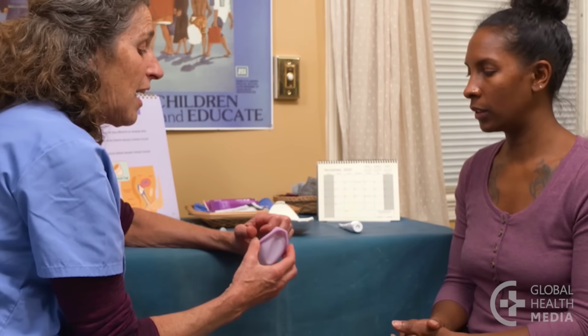If the diaphragm is too large, you may not be able to insert it completely and it will be uncomfortable. If it's too small, it won't fully cover your cervix. If the diaphragm doesn't fit well, don't use it for contraception.